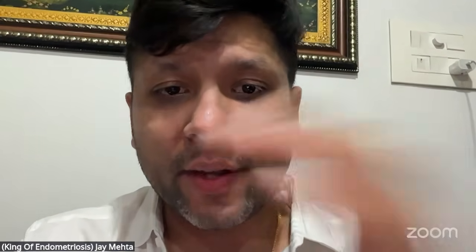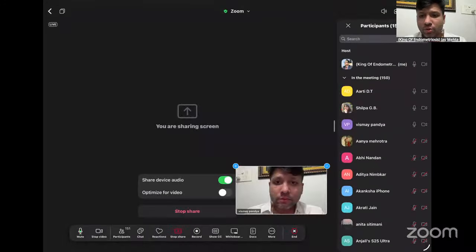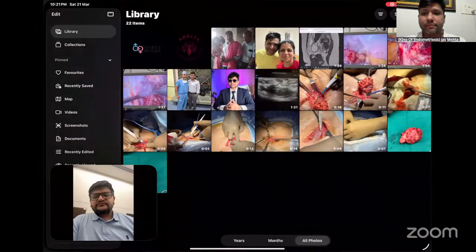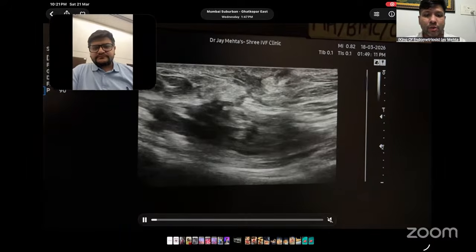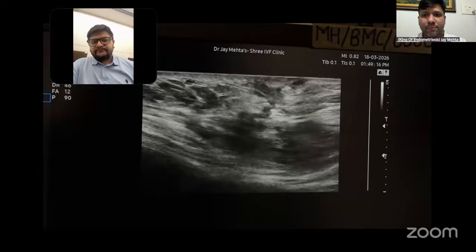Now we go to Vismay. I can play the ultrasound video for you, Vismay, and you can ask us to stop wherever you want us to stop. So I have downloaded that video for you. Again, I am going to be sharing the screen, and now Vismay will be speaking about the ultrasound. So kindly help me know if my screen is visible to everybody. Yes. Okay. So this is the ultrasound which Vismay has done. Vismay, if you want me to pause, I can pause.